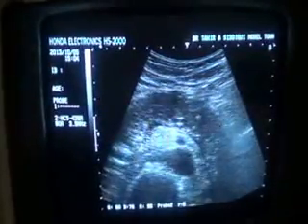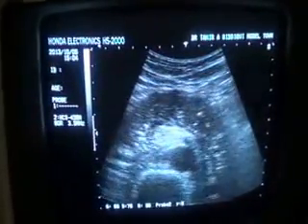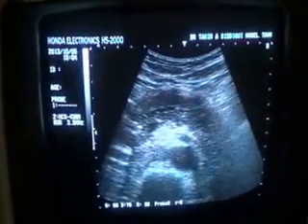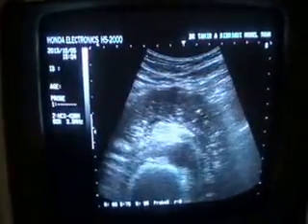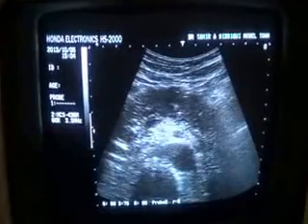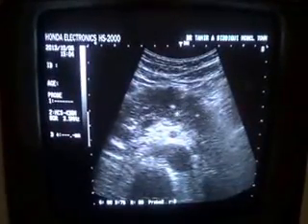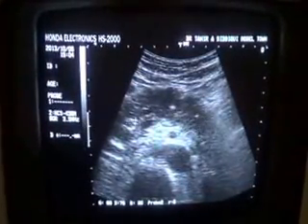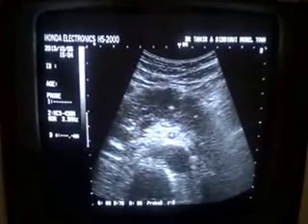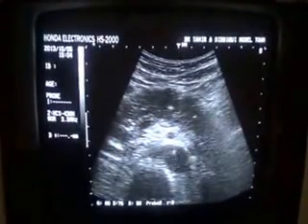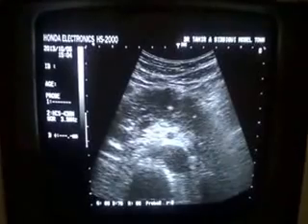This is an ultrasound study of the pancreas. This is the transverse section of the body of the pancreas. This is the pancreatic duct. This is the superior mesenteric artery in transverse section. This is the aorta.